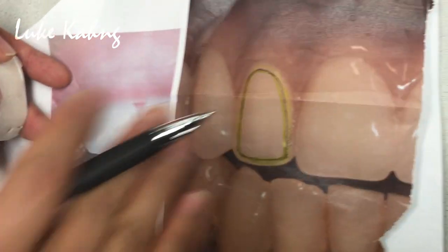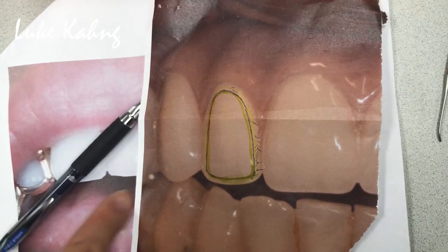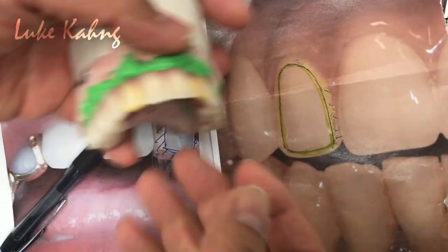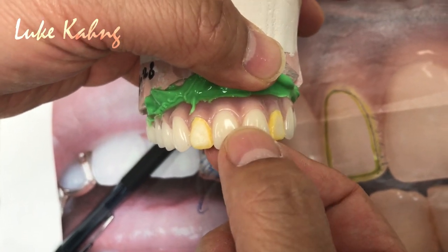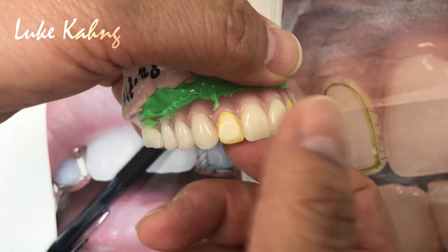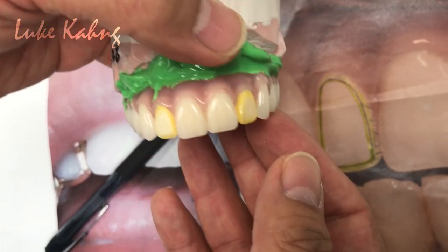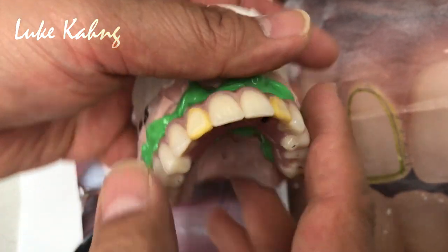So here's my dilemma. The doctor put down this, so we can decrease it that much. That was too thick, so we have to decrease it. The dilemma is that we're going to make full mouth zirconia restorations. If I put a composite, it's not going to look good after that. So that's why the doctor has to choose. Anyway, the other side too, so we wax it up.